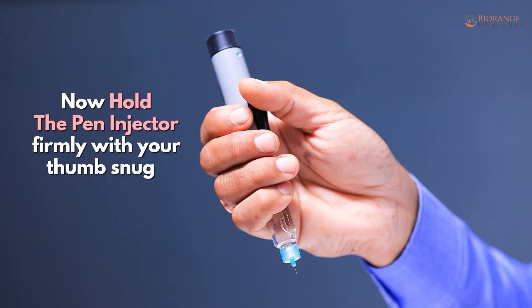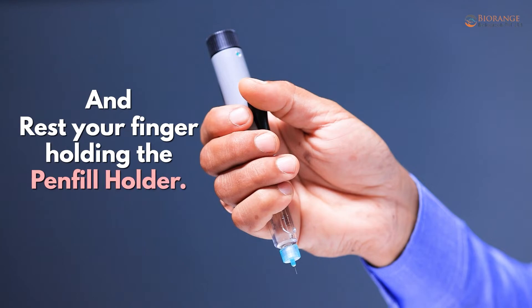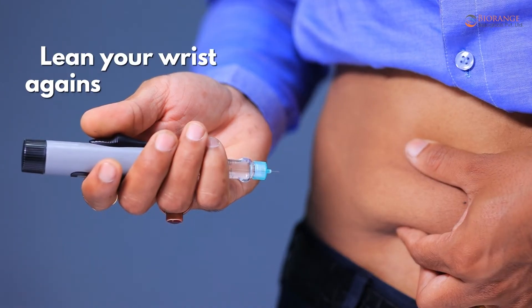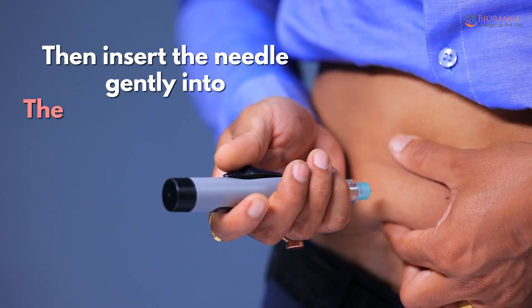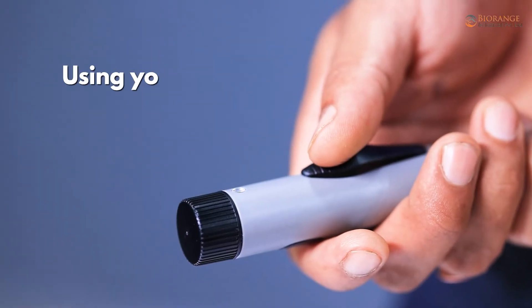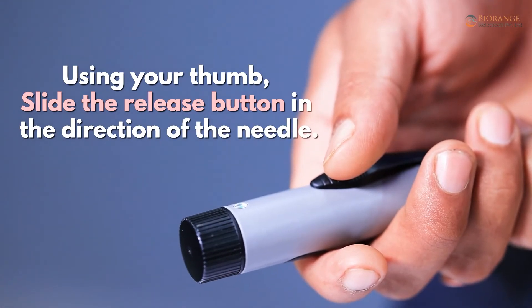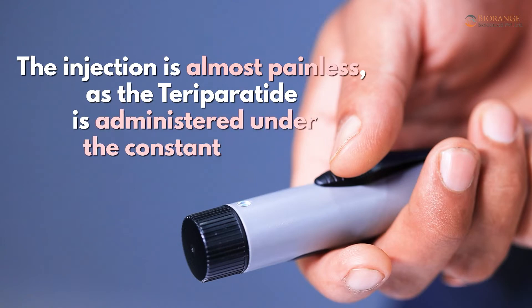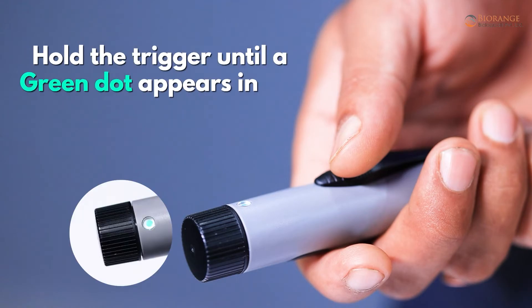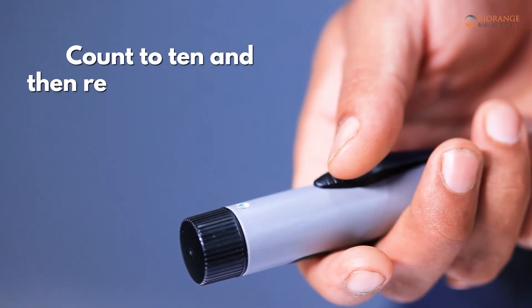Hold the pen injector firmly with your thumb snugly on the release button and rest your fingers holding the pen fill holder. Lean your wrist against your body to stabilize your hand, then insert the needle gently into the subcutaneous tissue. Using your thumb, slide the release button in the direction of the needle. The injection is almost painless as the teriparatide is administered at constant speed. Hold the trigger until a green dot appears in the window signaling the end of the injection, count to 10, then remove the needle.